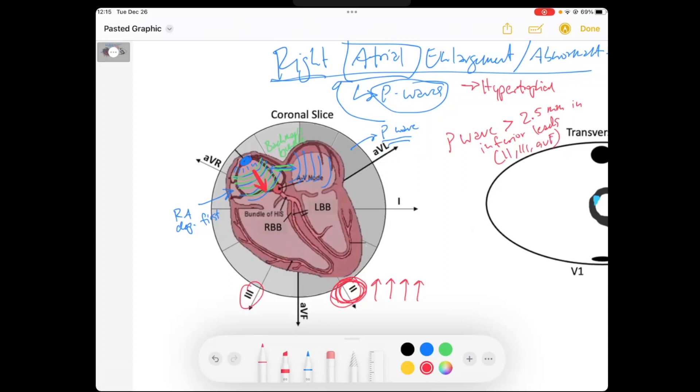So if the P-wave amplitude is greater than 2.5 millimeters in any of these inferior leads, which would be capturing that right atrial depolarization, then we can say that this would meet criteria for right atrial enlargement.